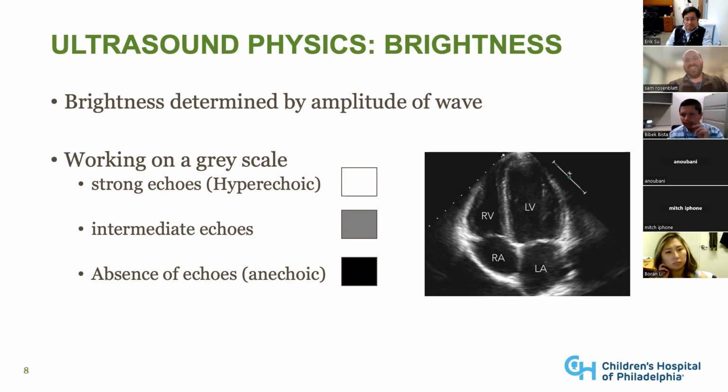So we're all dealing in shades of gray, which is where we all thrive in PICU and pediatric critical care, right? Nothing is black and white, right? It's all shades of gray, except for really anechoic and really hyperechoic materials on here.